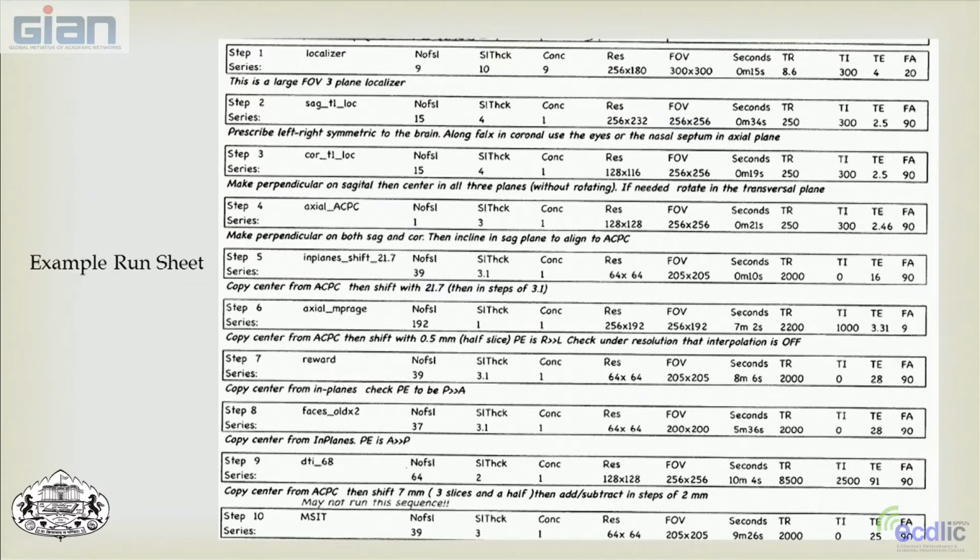So we usually warn our participants about this. They just lay still and relax. It's an anatomical sequence, so they don't need to be thinking anything or doing anything for DTI. But we do warn them that the table's going to shake a little bit so that they don't start to worry while they're in there.